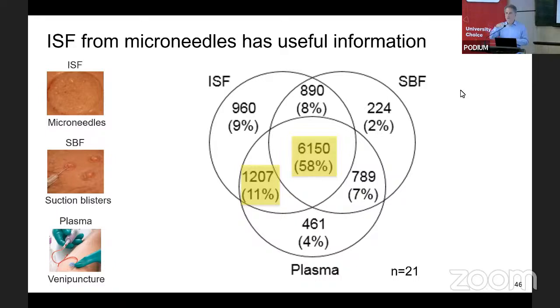These are sensors that are embedded in the subcutaneous space, and they stay there for a number of days, continuously measuring glucose concentration in the interstitial fluid of the subcutaneous space, which is in communication with the vasculature. There's about a 5 or 10 minute delay between a glucose concentration change in the blood, and then you see it in the interstitial space by these glucose sensors.